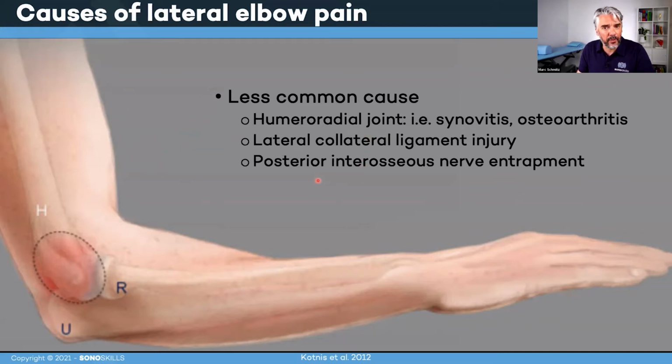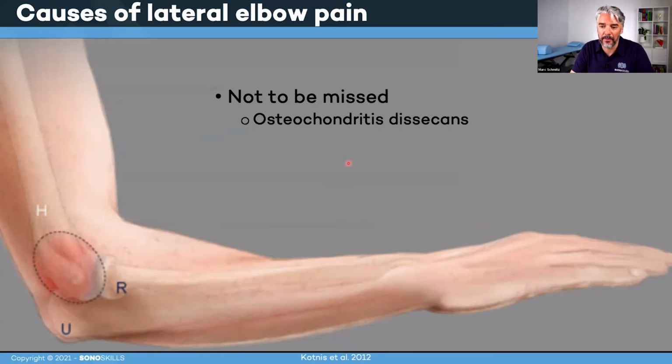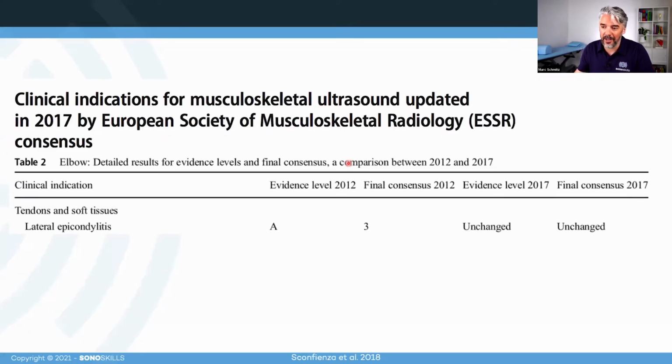And a very interesting one is the posterior interosseous nerve entrapment. This is a nerve, a deep branch of the radial nerve, which is in the supinator muscle, and this can impinge this nerve, can entrap, and this can mimic these lateral elbow problems. So also important to look at, and not to be missed is the osteochondritis dissecans. So, okay, so let's look at this number. This is a 3, scoring a 3, meaning that musculoskeletal ultrasound is the preferred imaging tool to use when screening for lateral epicondylitis. So you don't have to do other medical imaging.